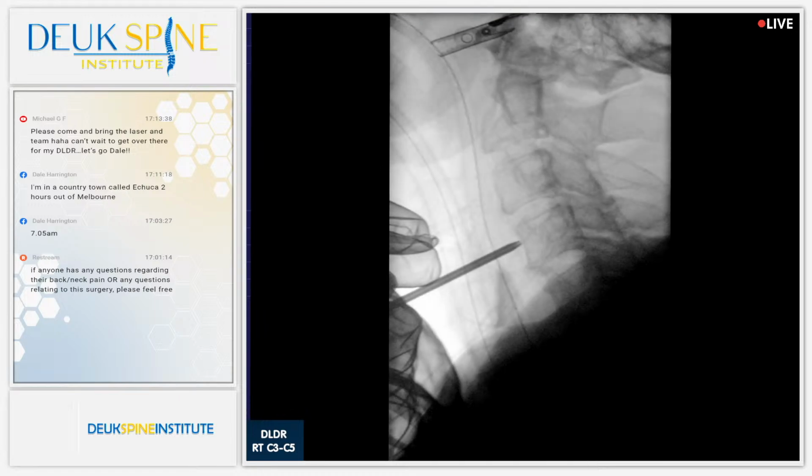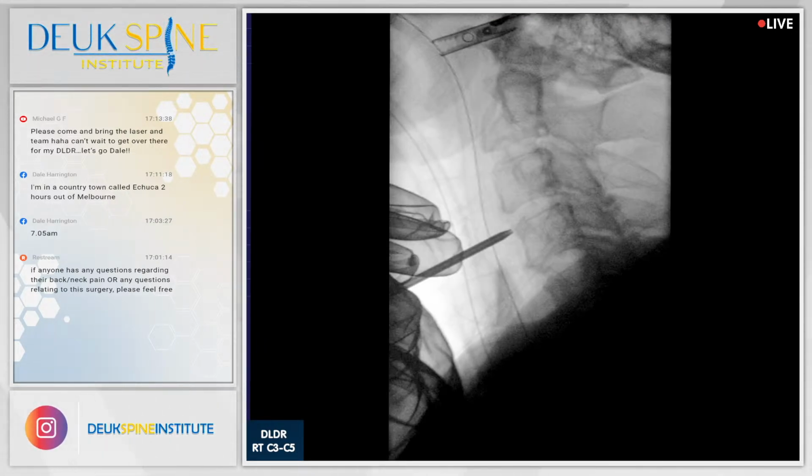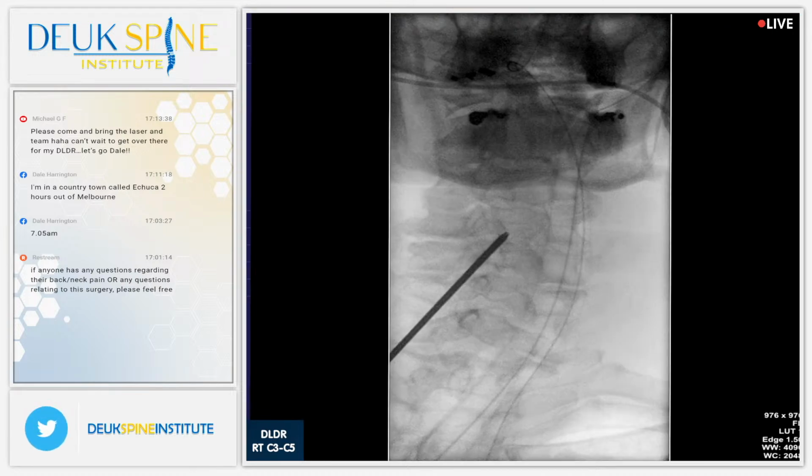Shot. So if you think about that, each patient has 2.4 discs that need to be fixed. Let's get an AP. And that means you got to bring them back 2.4 times on average to fix their neck. Well, why would anybody want to go under anesthesia 2.4 times or 3 times? I wouldn't. I just want my doctor to fix it all. Wait, stay there. In one shot. Shot.